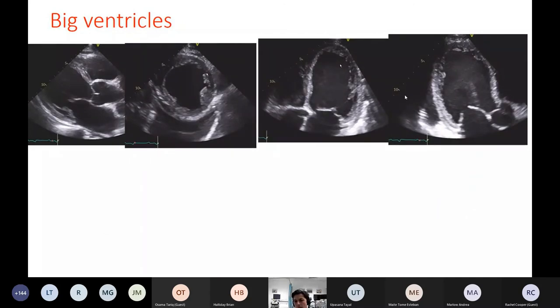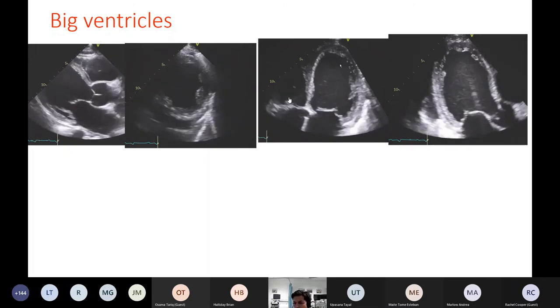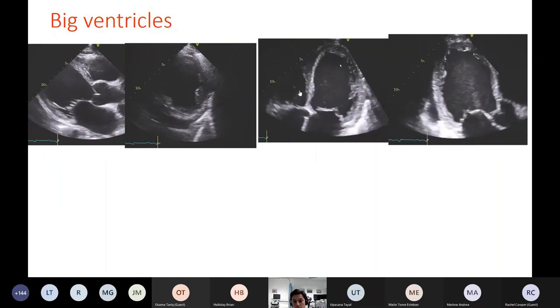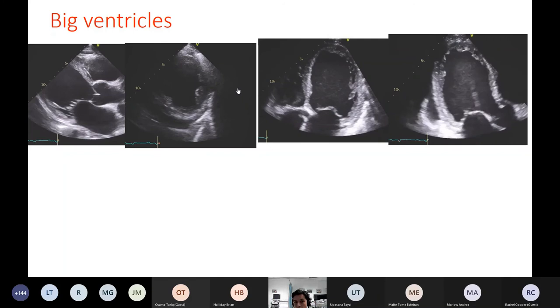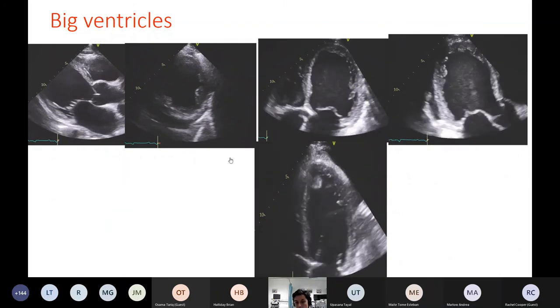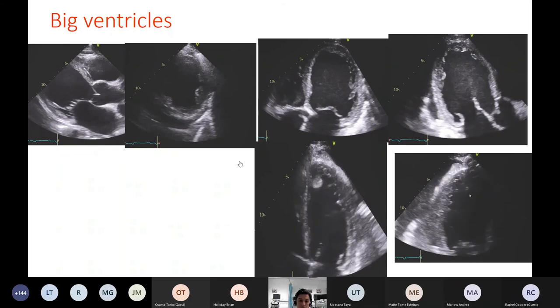So with that out of the way, I wanted to highlight a particular problem that we see with very large LVs. Here we've got a chap with dilated cardiomyopathy. And there's a particular problem with large left ventricles, which is that some images can look like they're lovely and on axis, when in fact they're quite foreshortened. In this case, these images, though they look quite nice, are actually hiding a huge part of the LV that was missing from these images. And in this case, obviously there's a thrombus at the apex.